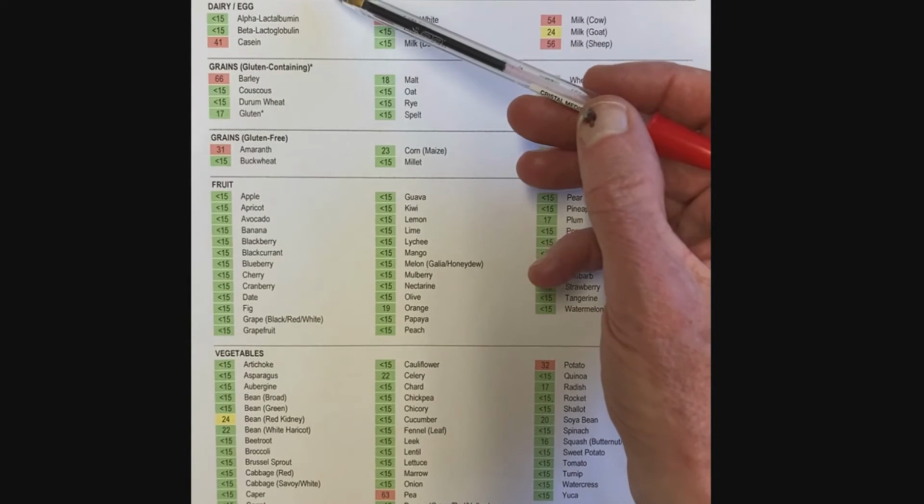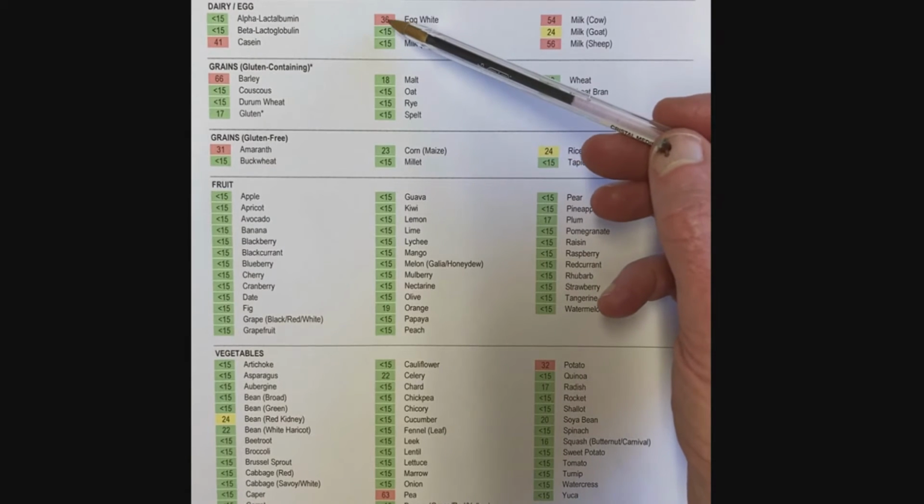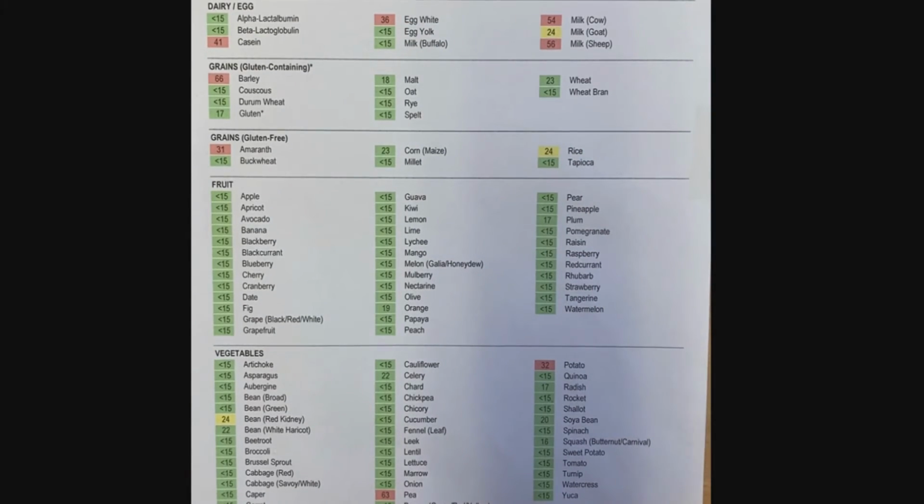But any food with an antibody score greater than 30 is highlighted in red, and these foods are definitely scoring above and beyond the norm. Such high antibody scores are showing how reactive the food is, and we need to remember that these elevated antibodies are signaling the immune system into inflammation modes, and such is the detail of the test.